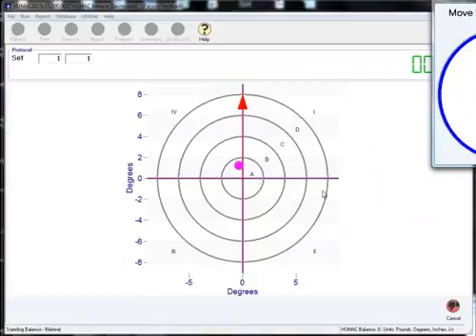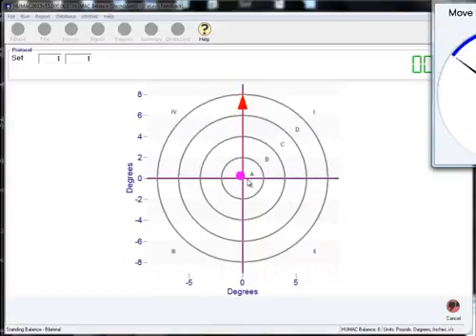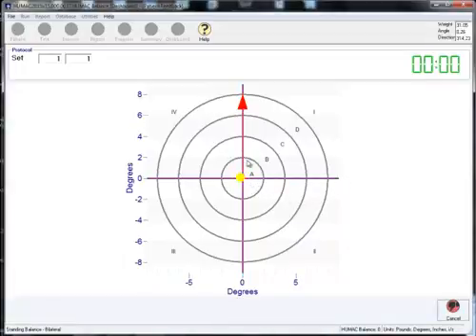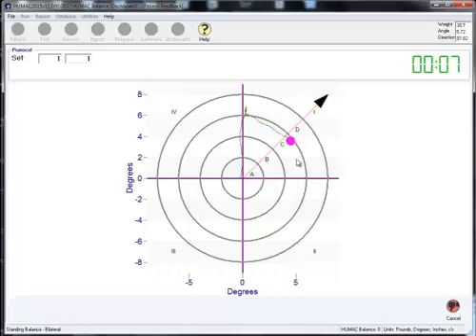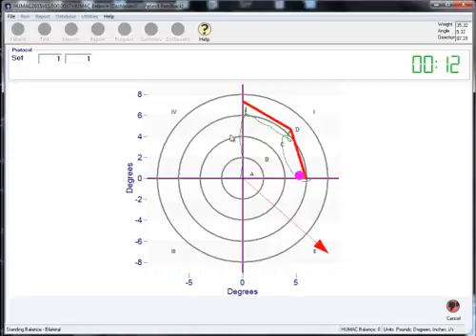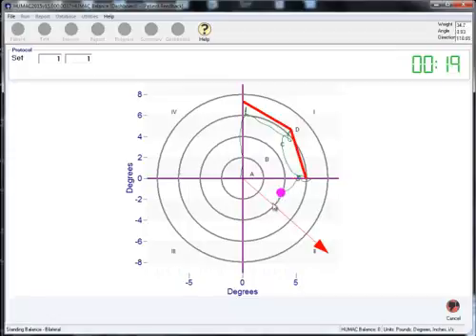The instruction for the patient is simple. With feet flat on the board, lean as far up the arrow as possible without bending at the waist. The arrow will move each time you mark the patient's ability to reach an endpoint. The average person can lean 8 degrees to the left, 8 degrees forward, 8 degrees to the right, and 4 degrees back.